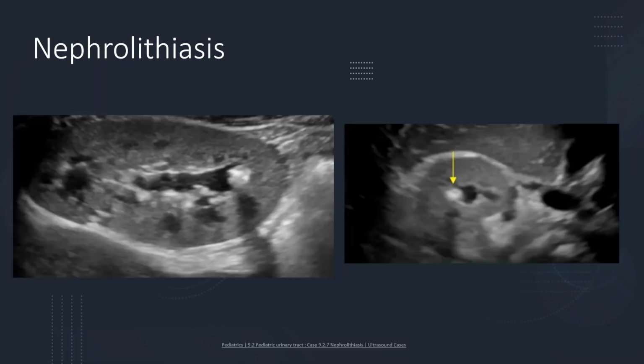One of the things that you guys will commonly hear patients say when you're ultrasounding them is, can you see kidney stones in this? The answer is yes. So you'll see this hyperechoic little rock here with a shadowing. It's very similar to gallstones or biliary stones. These are sometimes difficult to find, especially if rib shadows are getting in the way of your scan. They might be camouflaged in there, but you can technically see stones in the kidney.